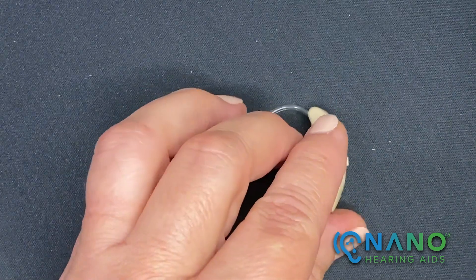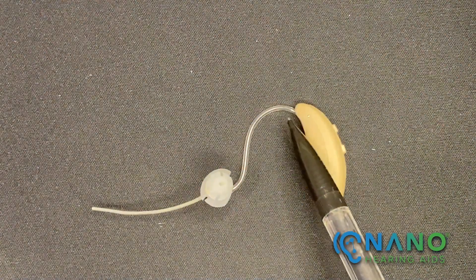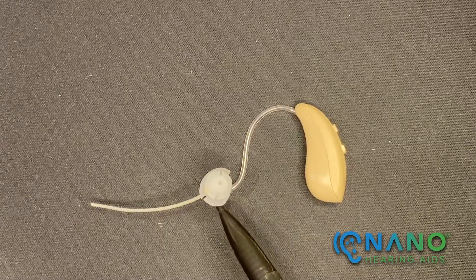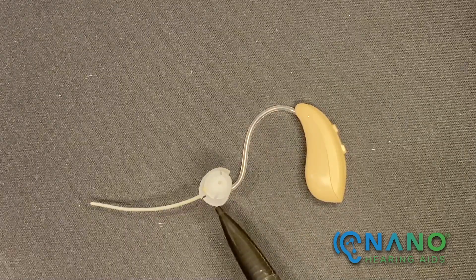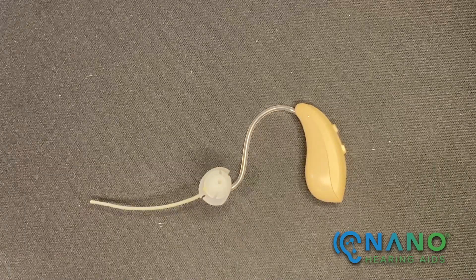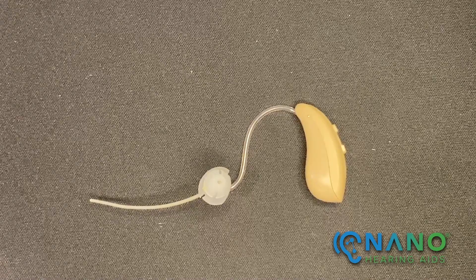The second component is the thin tube. It's connected to the hearing aid at the top and it delivers sound into the ear canal. The right and left hearing aids can be identified by the red or blue indicators on the thin tube near the dome.